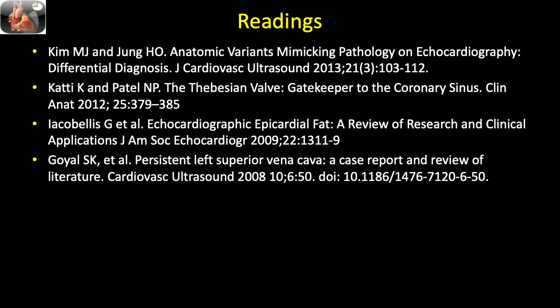rather than a pericardial effusion. CT imaging can definitively differentiate epicardial adipose tissue from fluid collection in complicated cases.